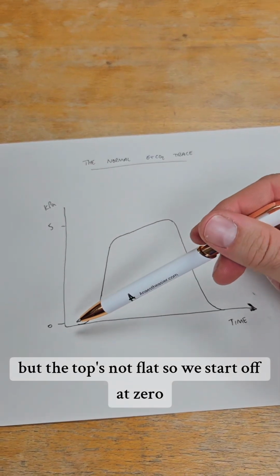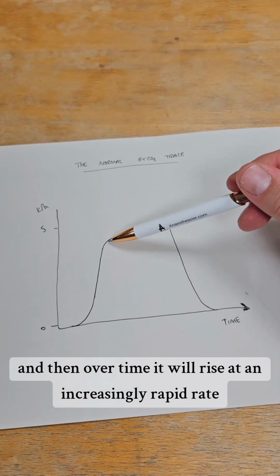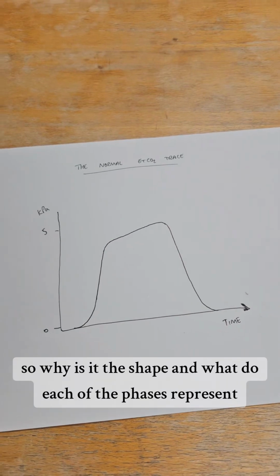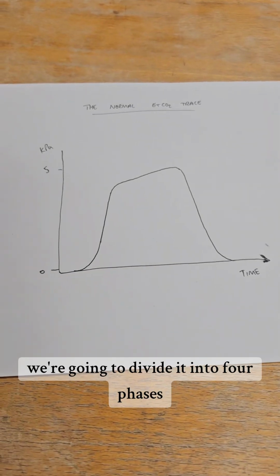So we start off at 0, and then over time it will rise at an increasingly rapid rate, and then it'll drift off and plateau, but still climb very slowly, and then suddenly drop again. So why is it this shape, and what do each of the phases represent? Well, we're going to divide it into 4 phases.